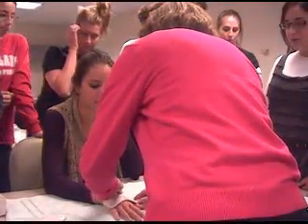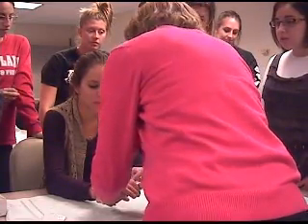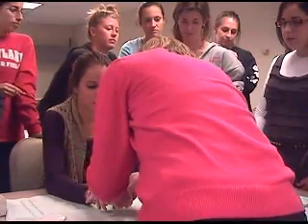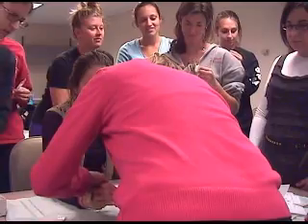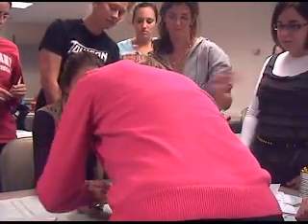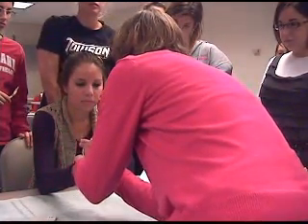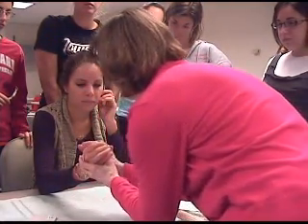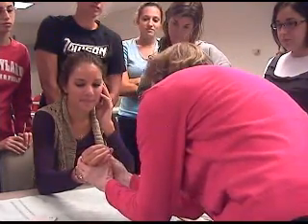Okay, right at her IP. So go ahead and upload this for me, Lauren. Go ahead and make a top shot. Okay, here's the trick with this one. Get your hand right in their web space and make that smooth. Get that web space and thumb right first.